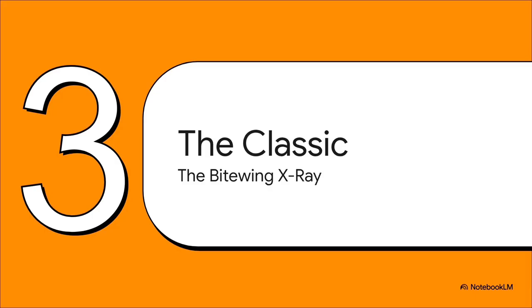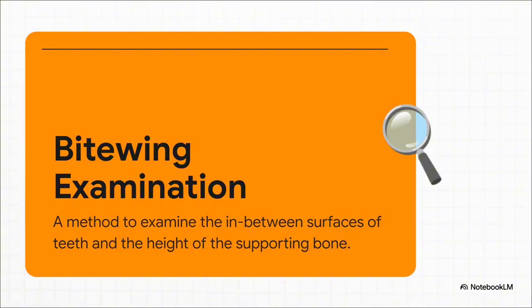Okay, so the room is prepped, it's safe, and we're ready to go. What's the most common type of X-ray they take? Oh, it's one you've almost certainly had yourself. It's the classic bite wing. Yep, it gets its name from that little paper or plastic wing that you have to bite down on. And its job is super specific.